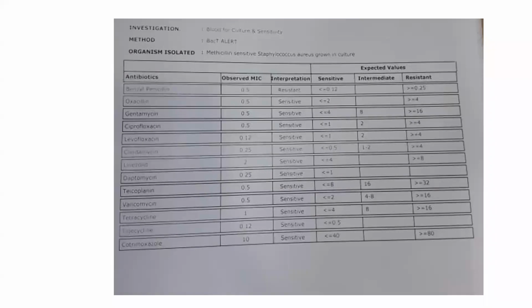Okay. So this is not determined by the microbiologist. They can choose a panel, but in that panel, what are the drugs to be tested? This is prefixed or pre-decided. There are different panels even in gram-negative. Let's say the NLF or non-lactose fermenter. There is a set of bacteria antibiotics which I want to choose. That will be automated. I mean, that will be fixed and that will be reported.